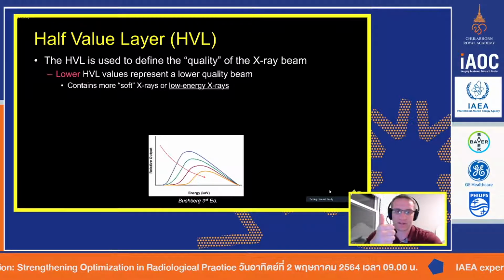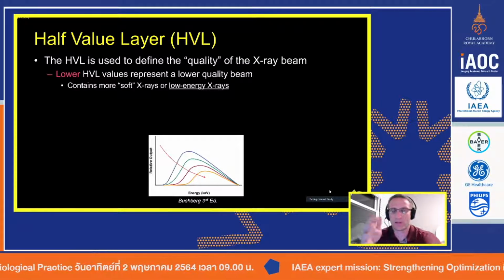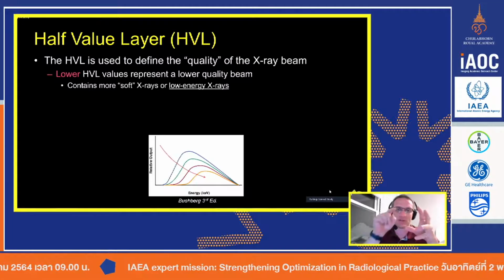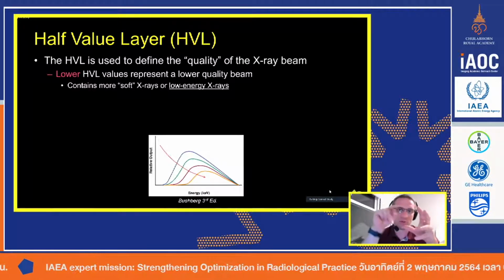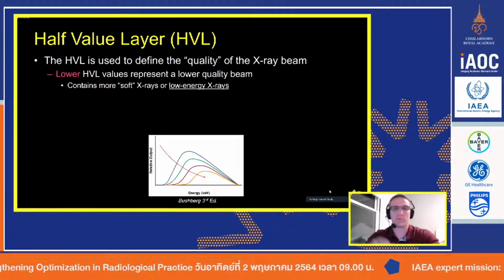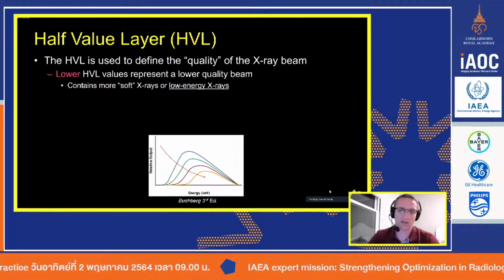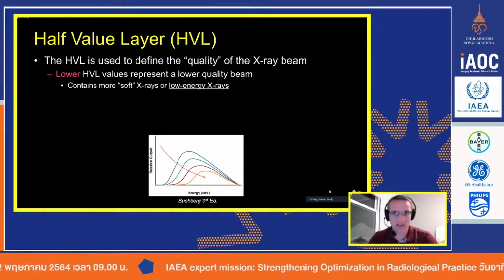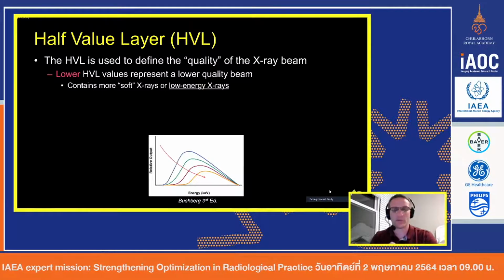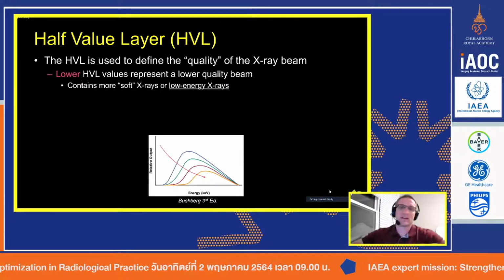What's another thing that affects contrast? The amount of filtration that we use. So when you're imaging, your X-ray machine will have multiple options for filters. Maybe 1 millimeter of aluminum, 2 millimeters of aluminum, maybe 0.1 millimeters of copper plus 1 or 2 millimeters of aluminum. Some combination of filtration is usually available. And we almost always will pick filtration for, as an example, the chest. What we do at our institution at Cincinnati Children's, we use 0.1 millimeters of copper and 1 millimeter of aluminum for almost every application except for very small body parts in babies, baby abdomens and chests.